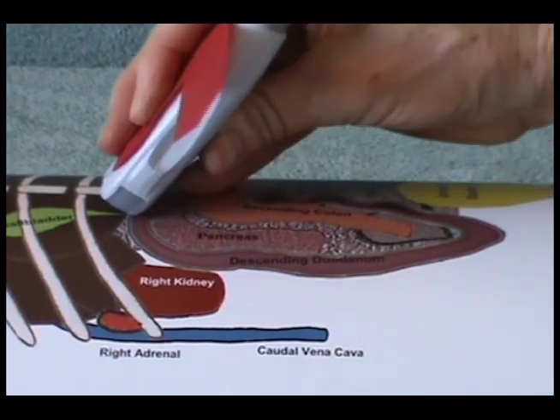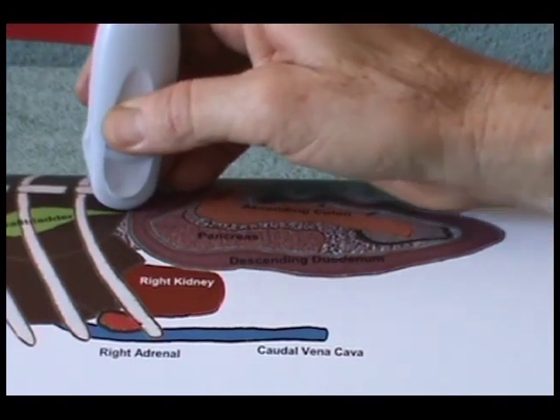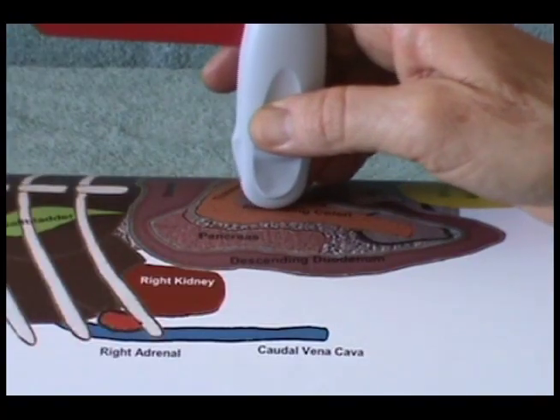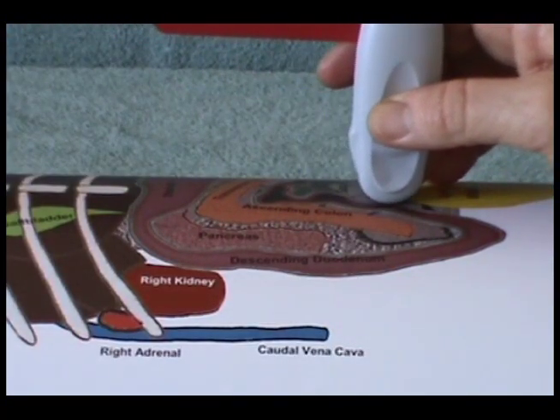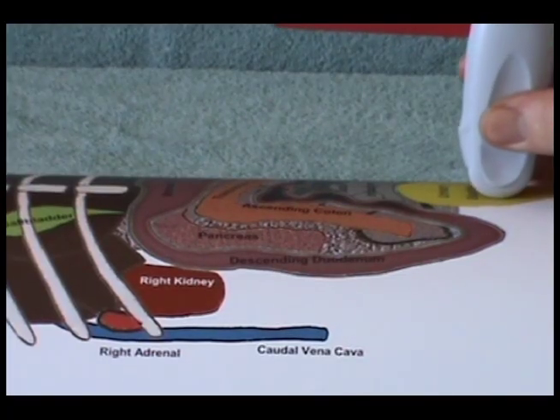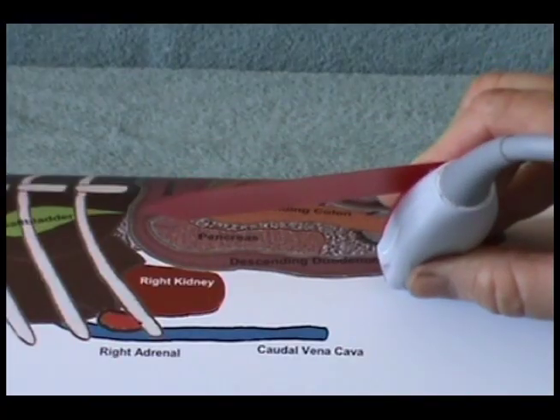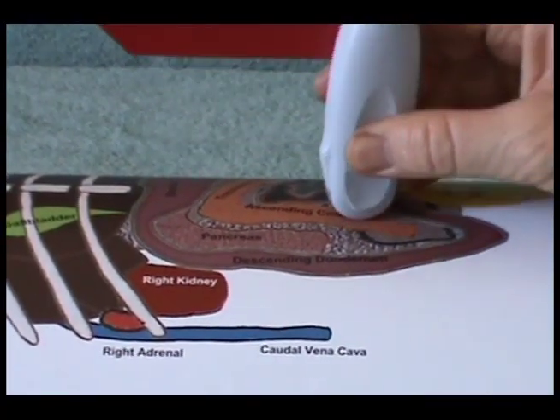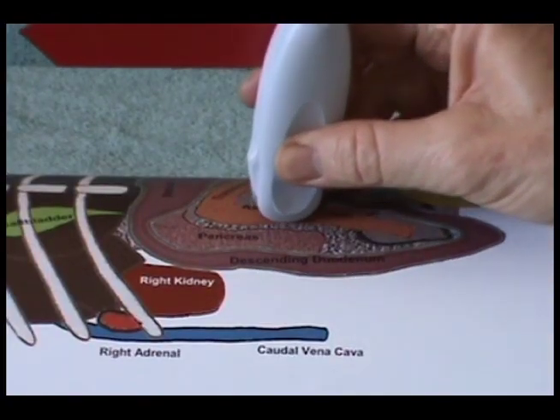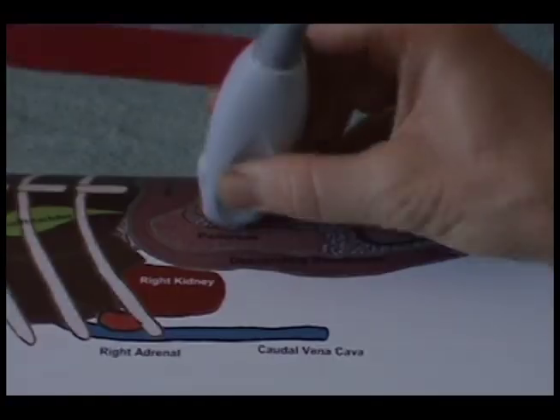Your brain will make a mental motion picture of your movements to help guide your hand in the future when you are looking at the ultrasound screen instead of your transducer hand. Pay particular attention to the tempo of transducer movements and the position of the transducer in relation to the patient's body or graphic. I will allow time for you to watch my movements and then copy them.